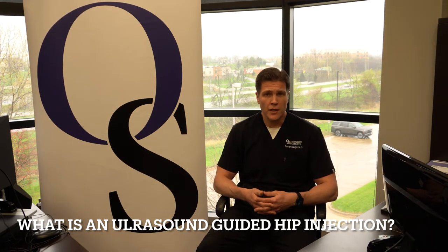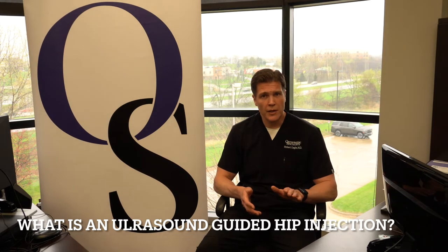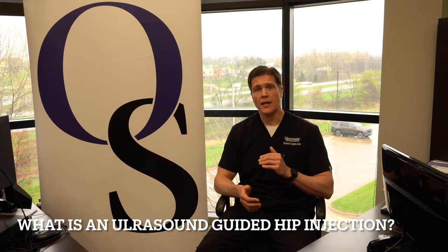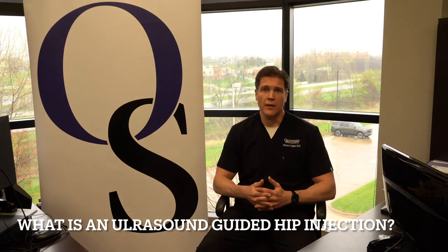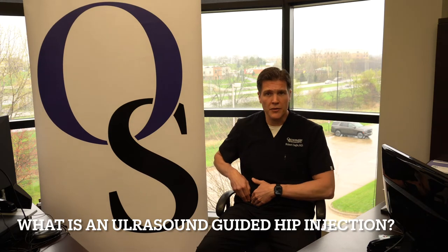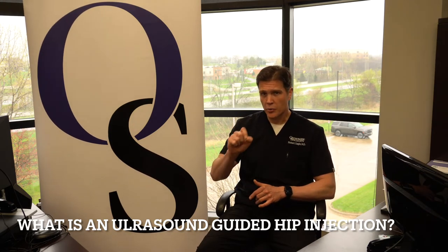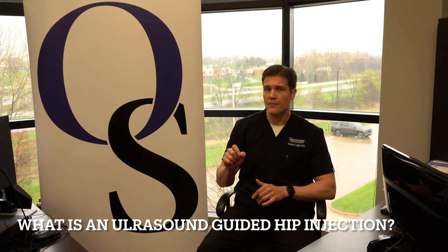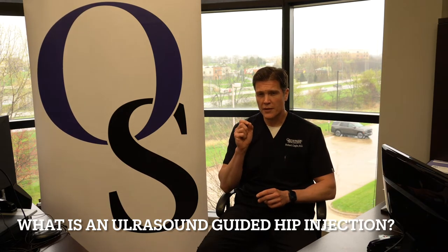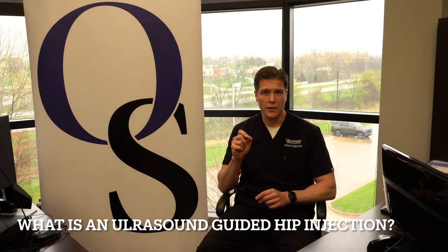Now, what an ultrasound machine is — it does not use radiation. It uses ultrasound waves to give us the anatomy deep inside. The hip joint isn't like your knee; it's deep within, buried under muscle, so if we just blindly try to put a needle into the joint, we can miss. The ultrasound allows us to give us precise location of where that needle tip is going, so we know we're putting the cortisone into the right place.